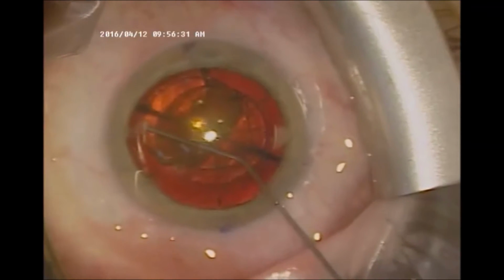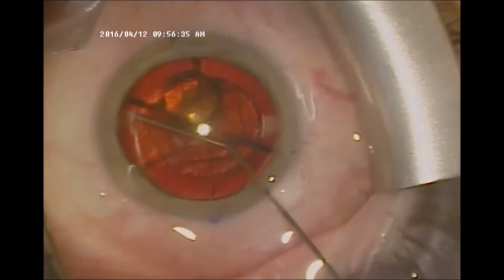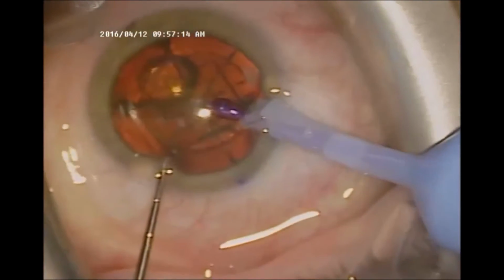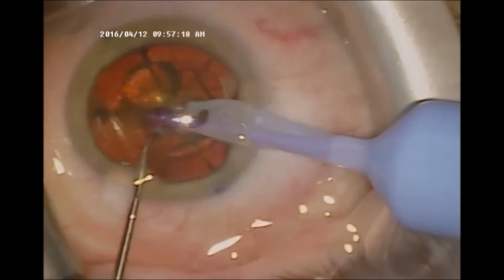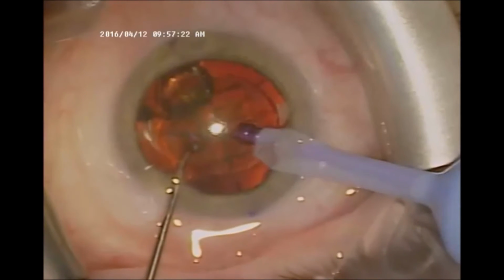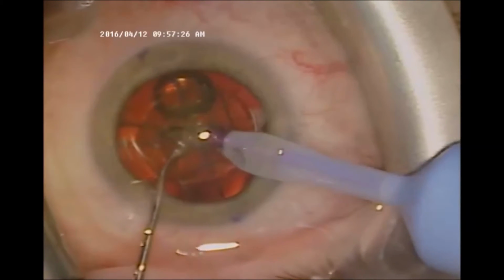Here I use BSS, or a type of saline solution, in order to free the lens from the capsule. I use ultrasound energy or phacoemulsification in order to finish the fragmentation of the lens. I make one pass here. Most of it has already been done by the laser.